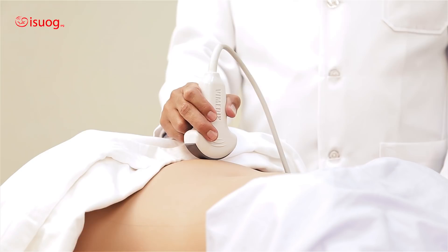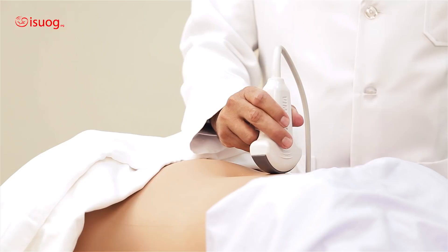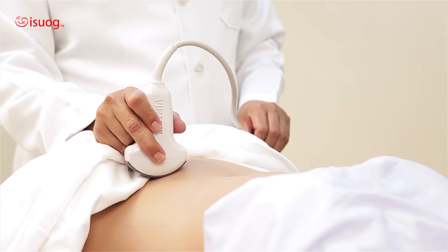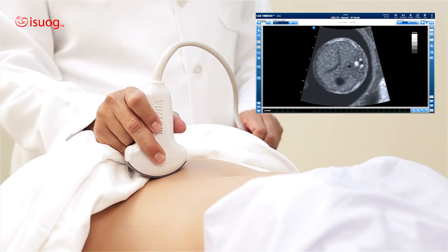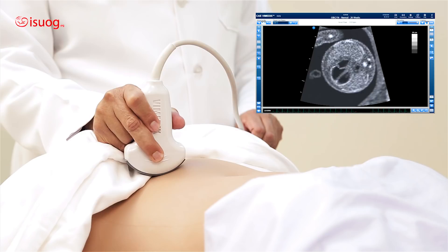If you look at the probe here, this is sliding on the broad axis of the probe. It can be done in different directions. Now I'm going to demonstrate how moving your probe on the broad axis will change the image on the screen. If you look at the screen, we have the abdominal circumference level. If I need to get the heart of the fetus, all I need to do is slide my probe on the broad, and as you can see, I'm moving from one transverse section to another where I'm getting the heart.